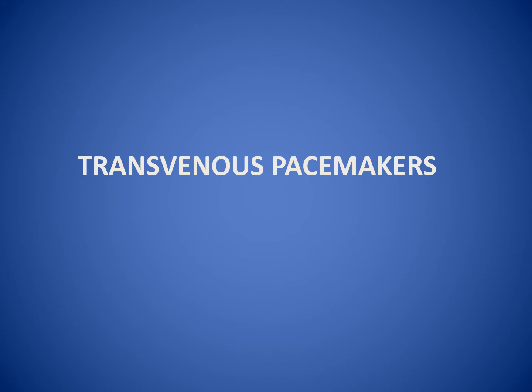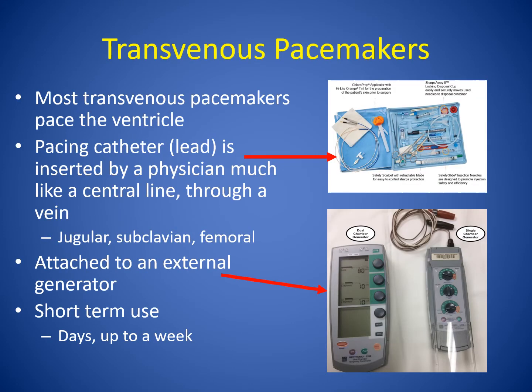Let's go into transvenous pacers. There are atrioventricular or AV transvenous pacing catheters, but I don't think anyone uses them around here. We're going to mostly focus on transvenous pacers that primarily pace the ventricles. Know the process for your facility and who would be doing them. Who inserts the pacemaker? Usually it's an interventional cardiologist or a critical care doctor, or they go to the cath lab. So know who puts those in.